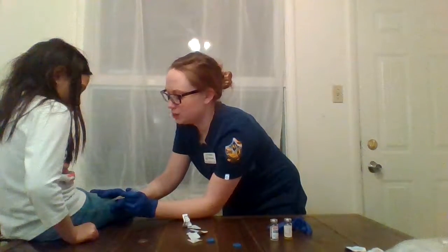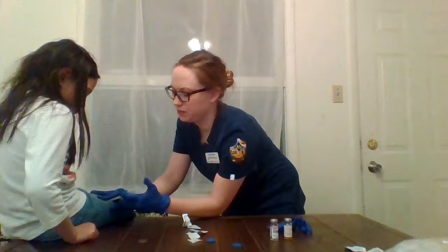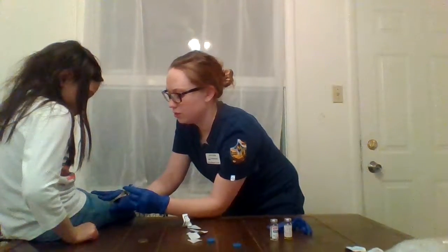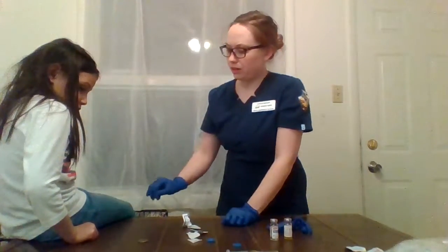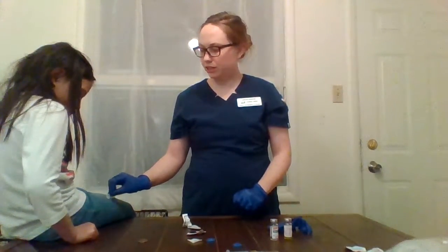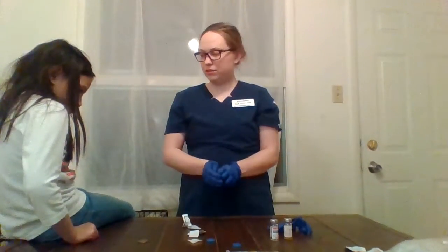After I have aspirated to make sure that there isn't any blood, I'm going to slowly inject the medicine. I'm going to remove the needle, discard it in the sharps container, let go so that the muscle snaps together, gently blot, but not massage. I'm going to ask the patient how they're feeling.